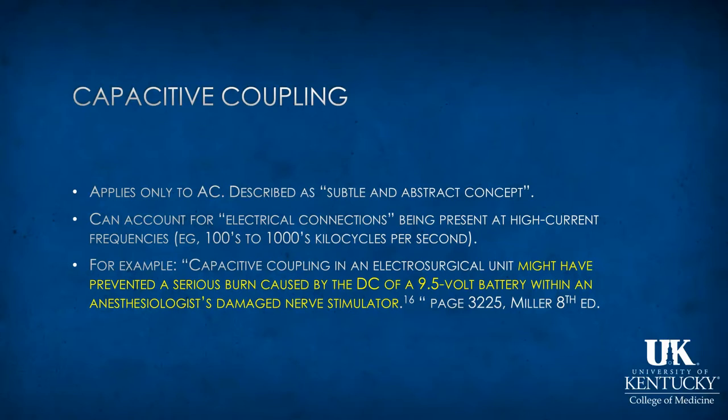Now, I did find a statement regarding capacitive coupling and the electrosurgical unit in Miller's, describing a burn received by a patient that was caused by the use of an older electrosurgical unit that did not have capacitive coupling, and had it been present, it may have prevented a burn caused by the direct current of a battery in a damaged nerve stimulator.